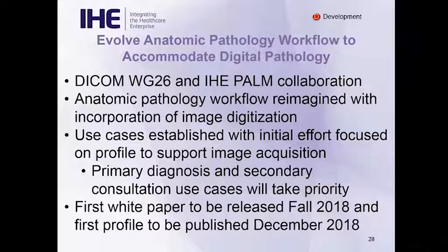So there are 10 use cases that have been established as the initial effort that we're going to focus on. At the recent meeting, a collaborative meeting between IHE Pathology and Lab Medicine and DICOM, there was a consensus that we really need to focus heavily on the acquisition of digital images and the workflows associated with that as the base starting point, really flush those out really well.